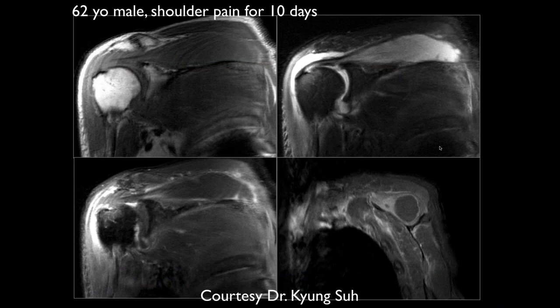Okay, Thomas. A 62-year-old male, shoulder pain for 10 days. So there's some fluid in the subacromial subdeltoid bursa, and there's a peripherally enhancing fluid collection, I guess deep to the deltoid, or sort of in the supraspinatus fossa. Yeah, it's in the supraspinatus muscle, I think.